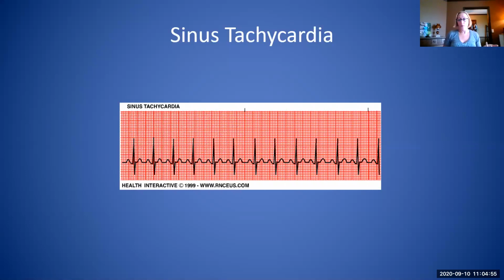Sinus tach can be normal for some people. Some people might just be slightly more tachycardic. We know other things that can cause tachycardia, just exercise, caffeine. You guys were all probably tachycardic this morning with caffeine and stress at 9 o'clock this morning. So certain things can cause tachycardia, but we always just want to, again, assess the patient.